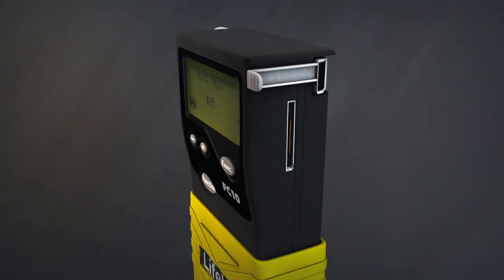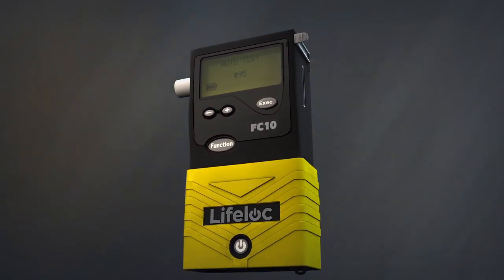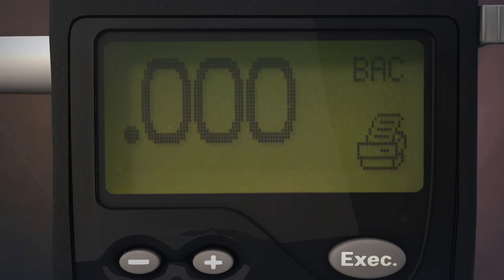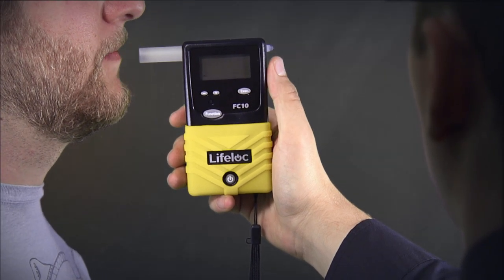Visual cues and graphs are also used to communicate with the operator to ensure proper testing. Examples are LifeLoc's unique breath flow graph, which indicates whether the subject is providing a proper breath sample, is being uncooperative, or is incapable of providing sufficient breath.